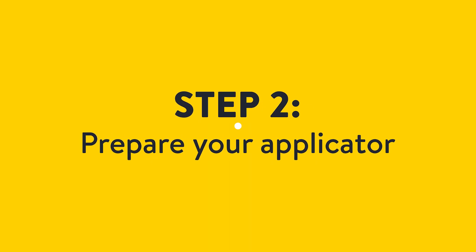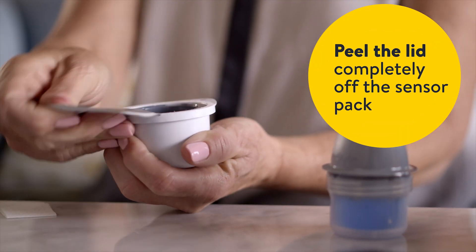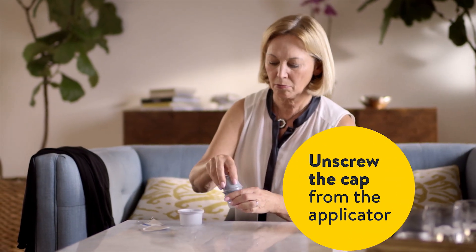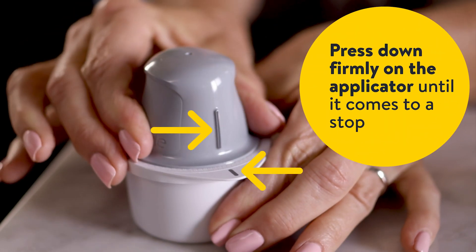Next, you'll prepare your applicator. Remove the sensor pack and applicator from the box. Peel the lid completely off the sensor pack and unscrew the cap from the applicator. Place the applicator into the open sensor pack and line up the marks. Press down firmly on the applicator until it comes to a stop.